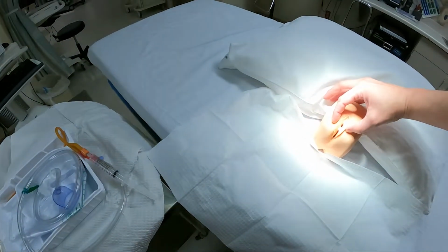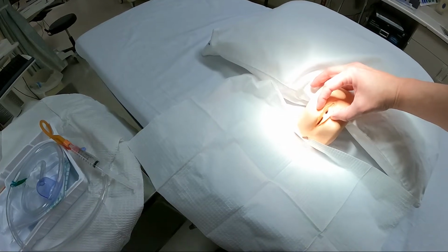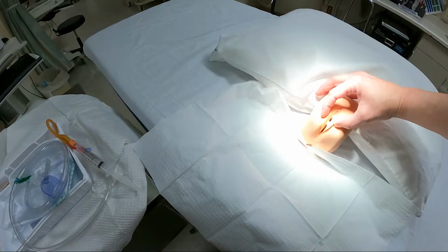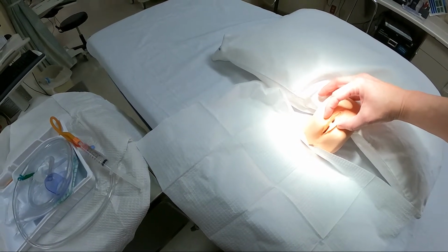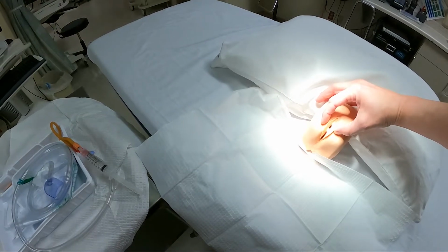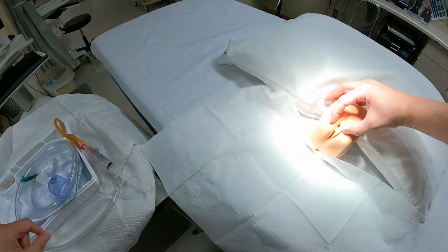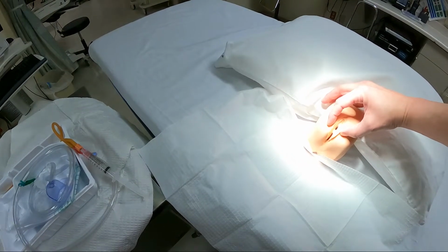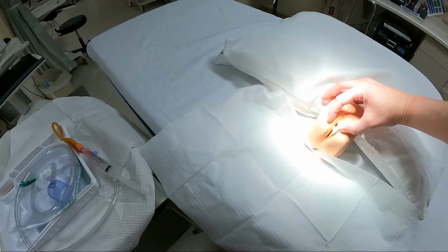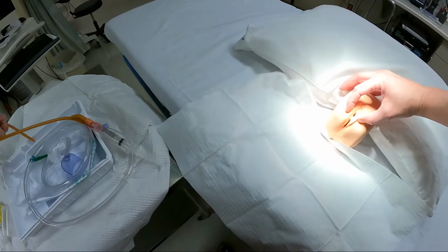Now, one of the big secrets of not getting a urinary tract infection is prepping correctly. So remember, you clean them up with a washcloth, especially if there's any yeast or fecal material, or if they have poor hygiene. Then you move on to using the Castile soap wipes. You don't just use the Castile soap wipes and throw them to the side, or you guarantee an infection.